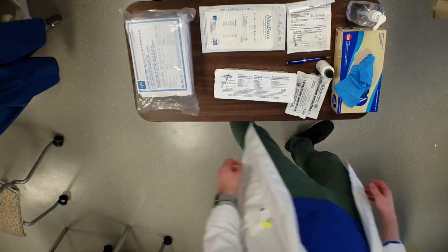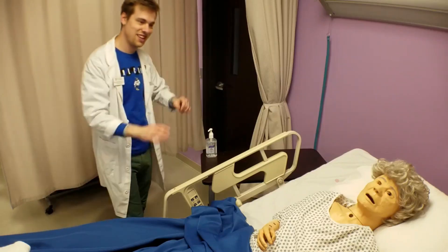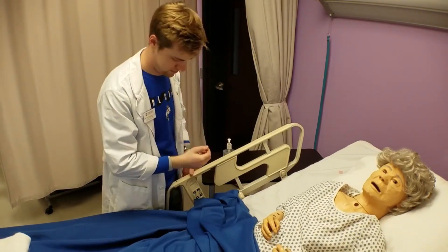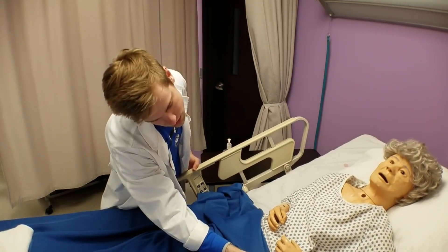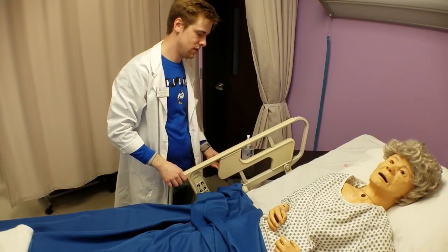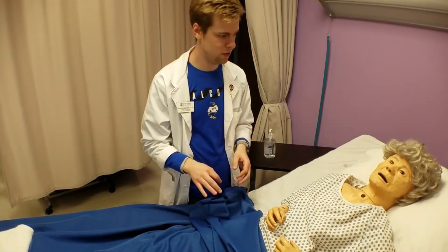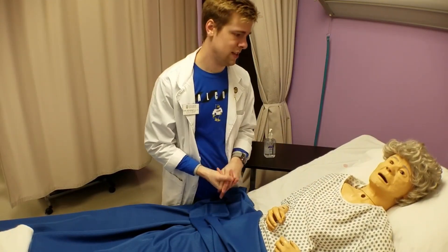You are now ready to enter the patient's room. When you first enter the room, wash your hands and introduce yourself to the patient. Make sure that you identify the patient using two identifiers and assess for allergies before performing any assessments or procedures. You can raise the bed to an appropriate height while doing this if you wish.